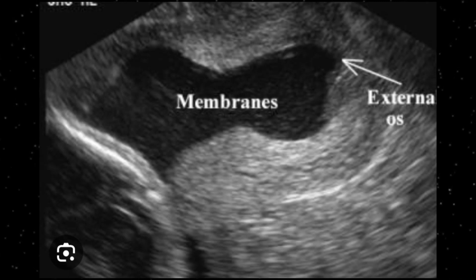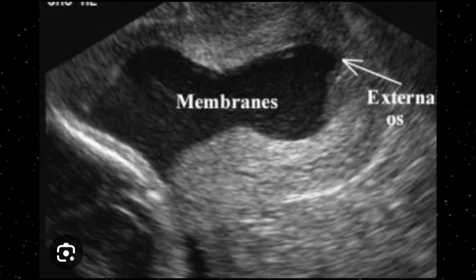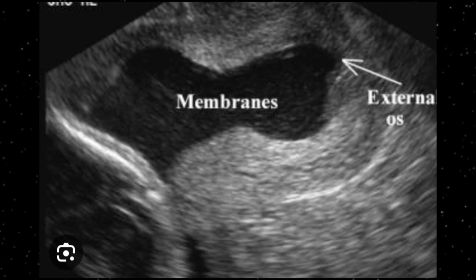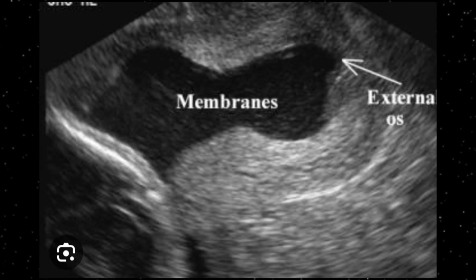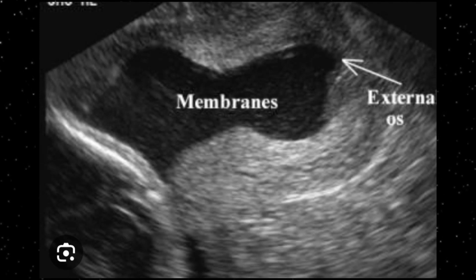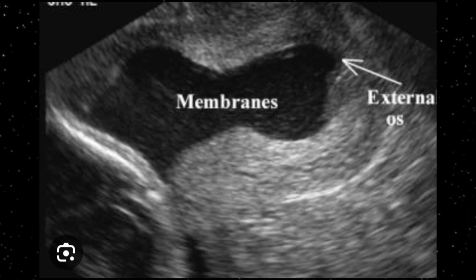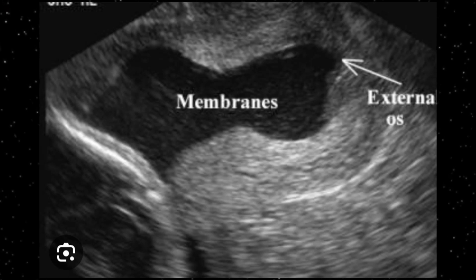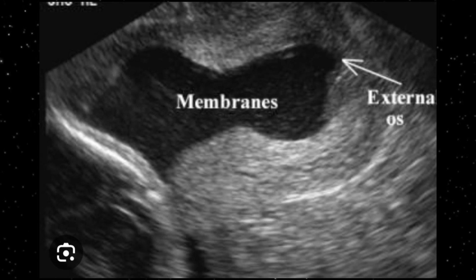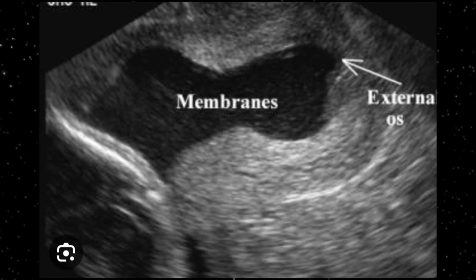Mention on the report the cervical canal length, measure the cervical length, and beside this mention that there is no integrity of the internal os, it's markedly dilated, and a part of the membrane has been expelled into, or rather is filling, the endocervical canal, and it is directly touching the external os. Beside, amniotic fluid is also filling the endocervical canal. This is severe cervical incompetence, and immediate attention is required to save or to prevent the pregnancy loss.